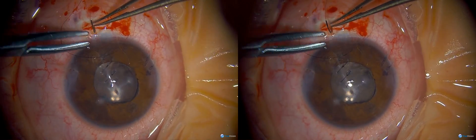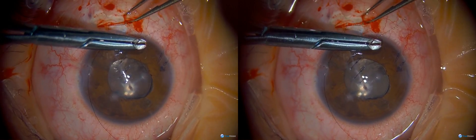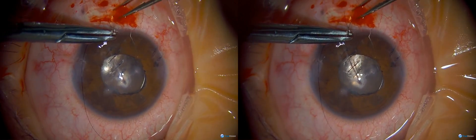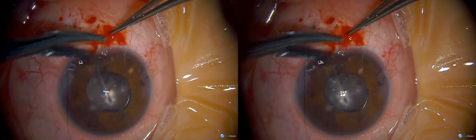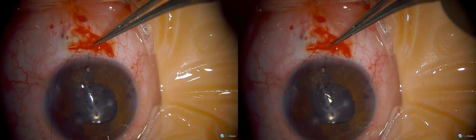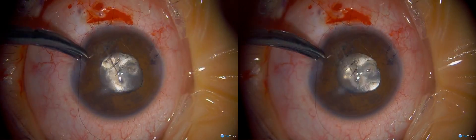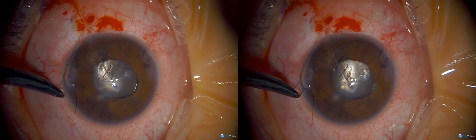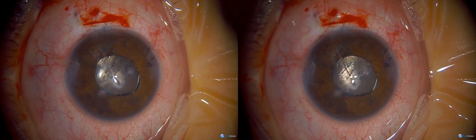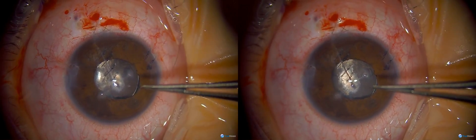In children, you have to suture most incisions because their sclera is too soft — they're not going to be sutureless no matter how small the incision is. I don't like clear corneal surgery in children that much because you have to suture regardless, even with a small incision. It's a nice single stitch if you just want to run one stitch across.